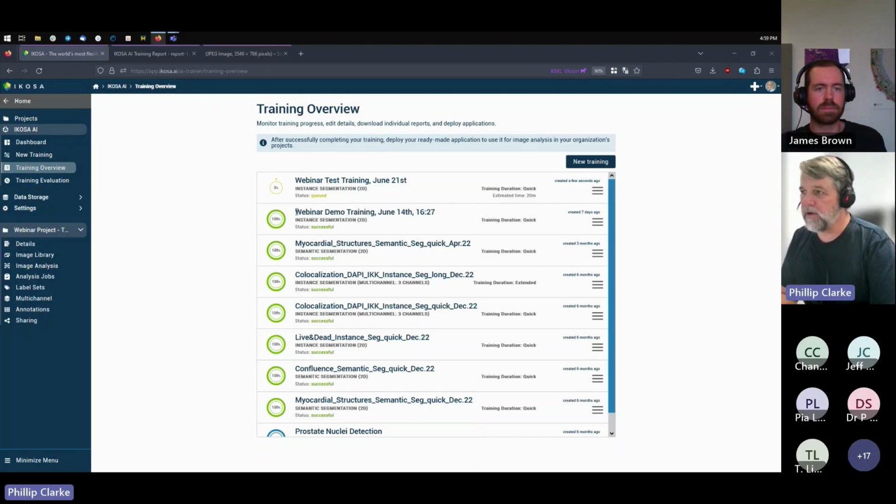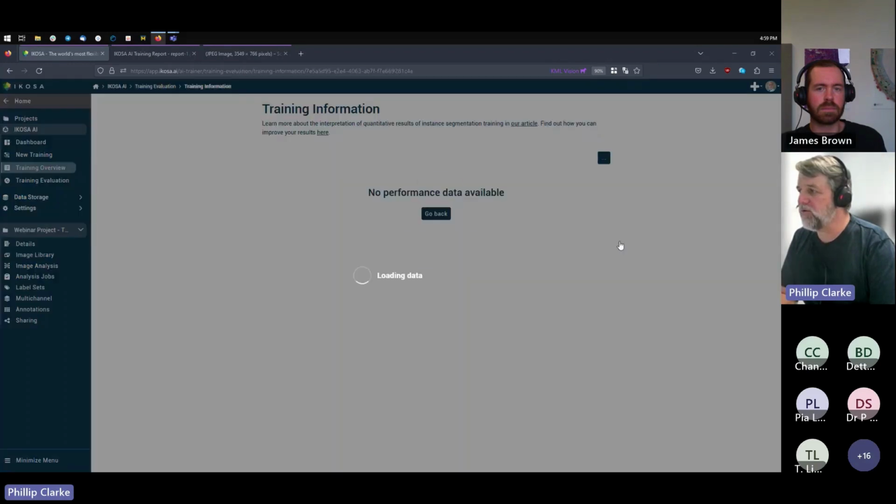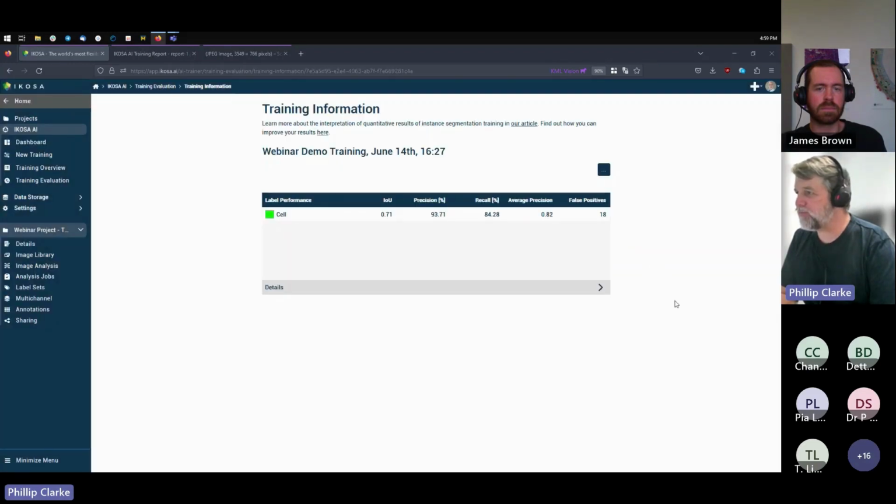So the one that we did in the webinar last week, this one here on June 14th, we can have a look at the results. The one we submitted now will take about 20 minutes, even though it's quick training. So we'll have a look at the one we completed last week, and we can have a look at the training information, and we have numbers.